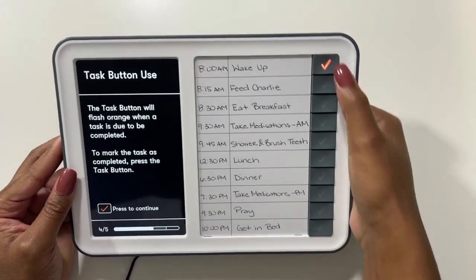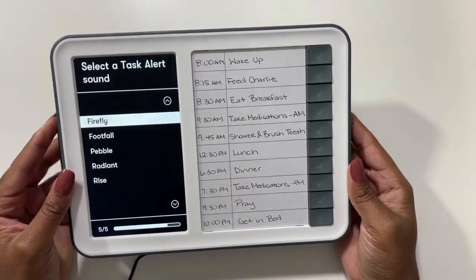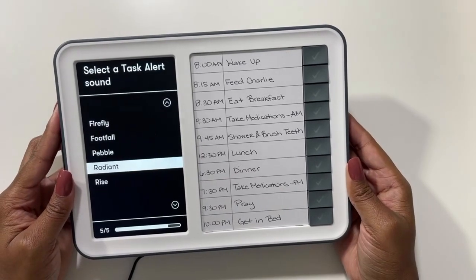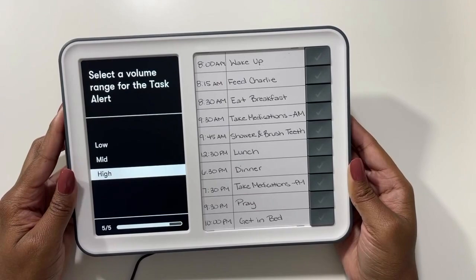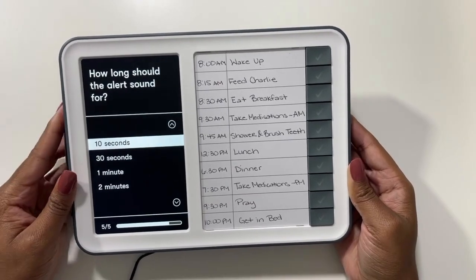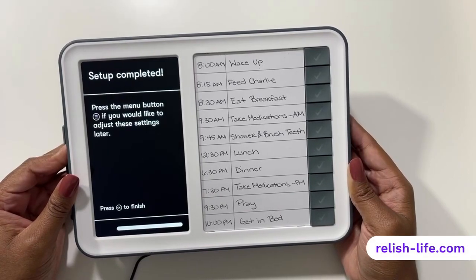Once finished, the device will guide us on how the task alerts work. We'll choose a sound we like, the volume we want it to be, and how long the alert should play. We'll click through the remaining prompts and we are all done.